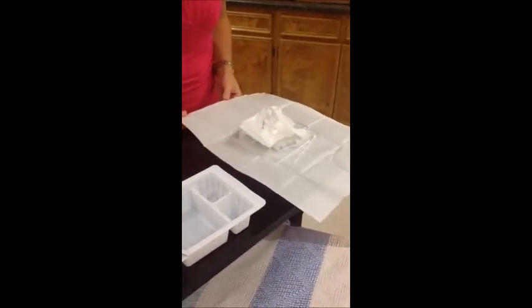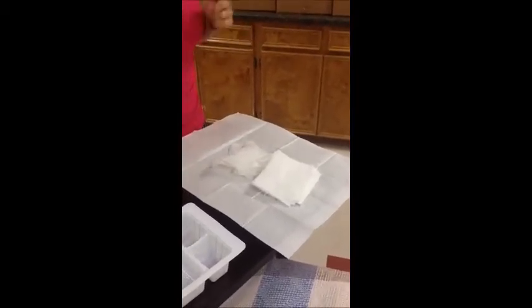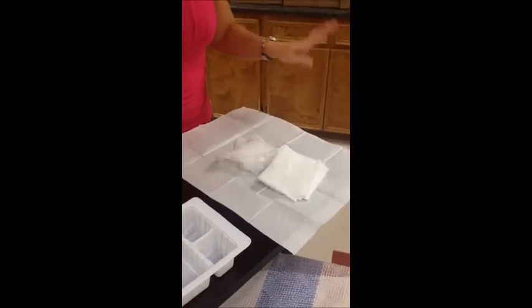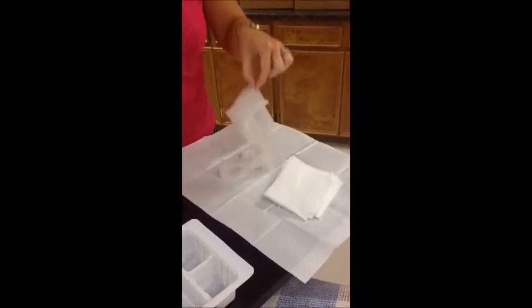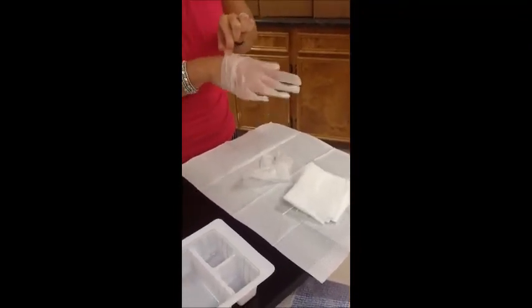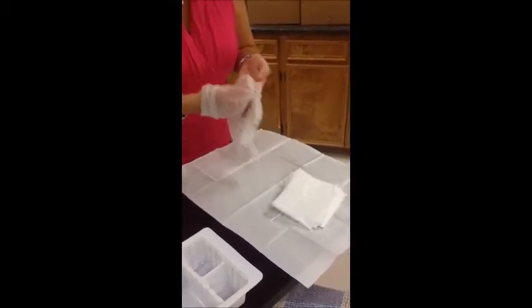Okay, as you can see, my gloves are buried. Yay! Well, I'm just going to have to get them out. Still sterile. I just dumped it over. If you get it on the 1-inch edge, then you've broken sterile field and you need to start over. But I did a pretty good job. So I'm going to take my cuff on my first one. Put the glove on. You know, the first one is a pinch. The second one is a scoop.